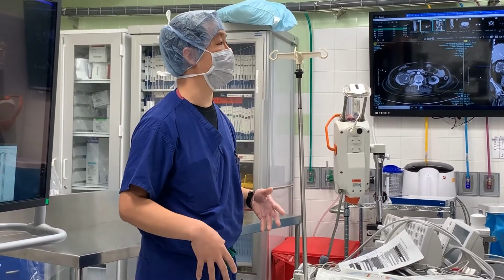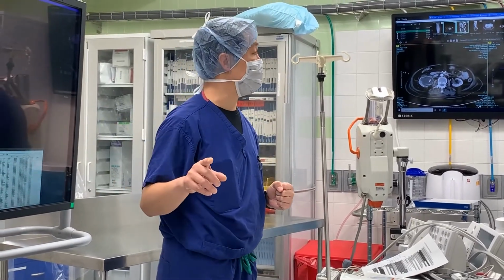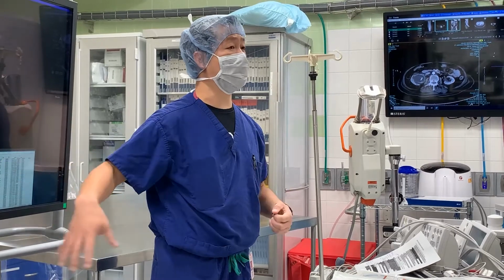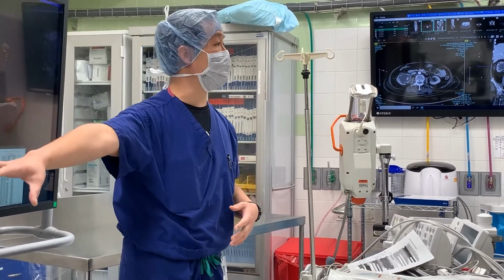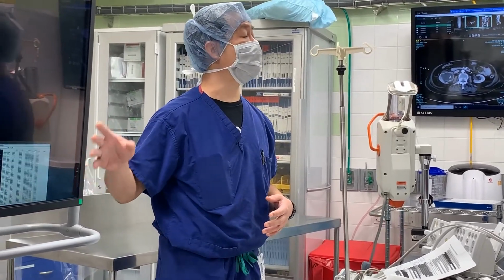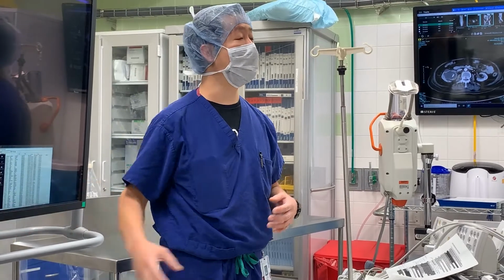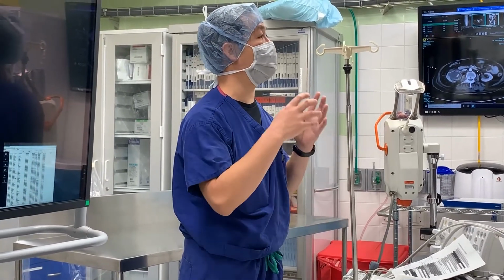In such a case, the kidney may not be obstructed, but they're just peeing freely into their body, and so we put in perc nephs to divert the urine away so that then the ureter has a chance to heal. Or sometimes we put something further down so that we act as a scaffold for the ureter to heal around our stent or our tube. Okay.